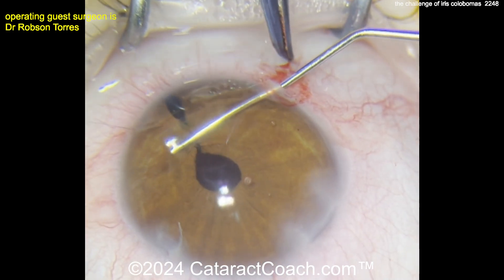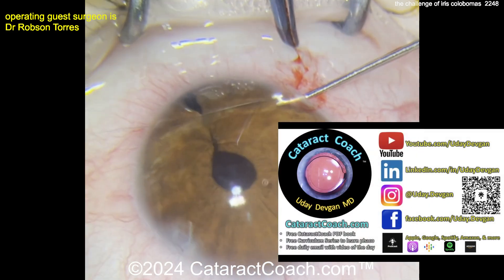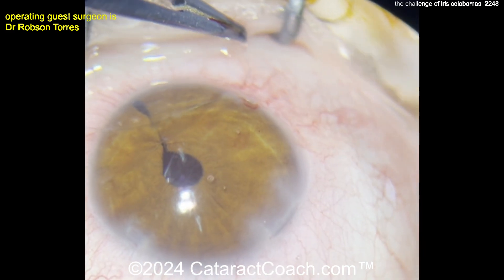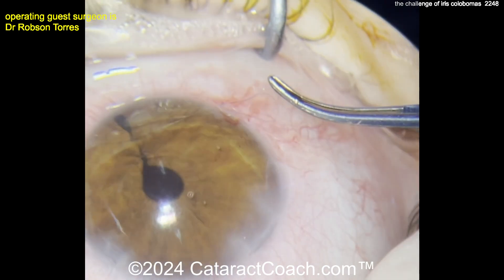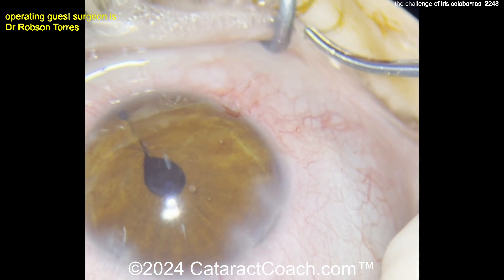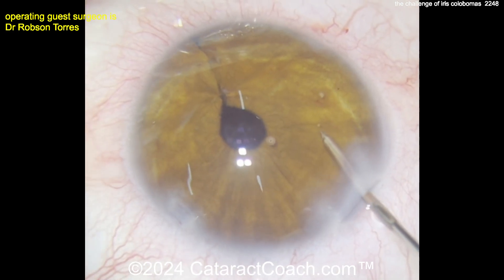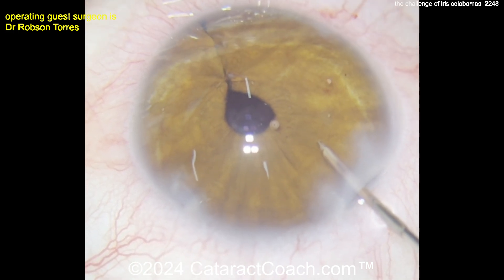Pulling the suture through. By the way, check out CataractCoach.com — our teaching website with a great deal of archived material, a free curriculum series, a book, and a podcast every week. It's a much easier way to search for videos than YouTube. Back to the video: the iris is being sutured up beautifully — looks like one, two, three sutures. And now here comes the magic: the endocautery. Just a little bit of cautery in the iris stroma.